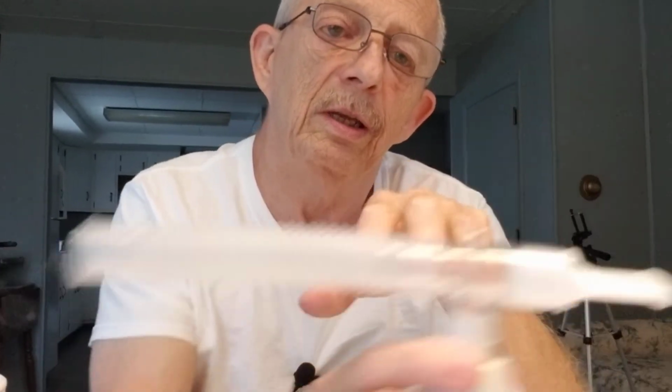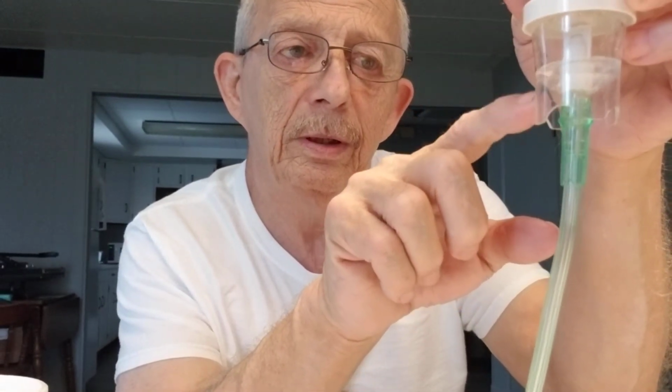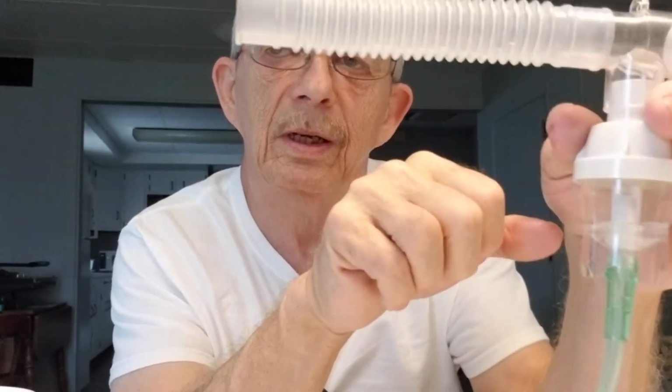Once it's done, you'll see no more vapor, and the medication you see here in the tube will be gone. That's how you know your breathing treatment is finished. You'll have no more vapor to breathe. Your medication will be gone. Now, while I take this treatment, you stay tuned and I'll be right back with you.